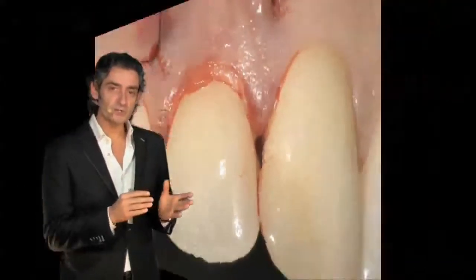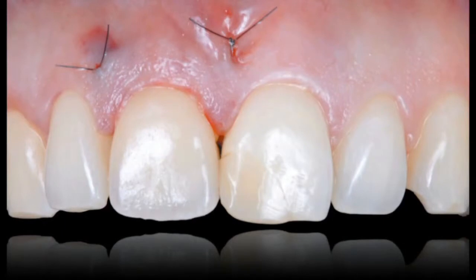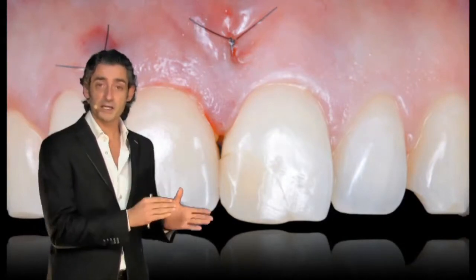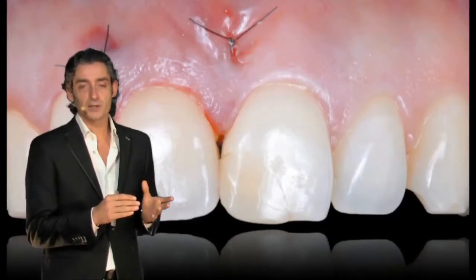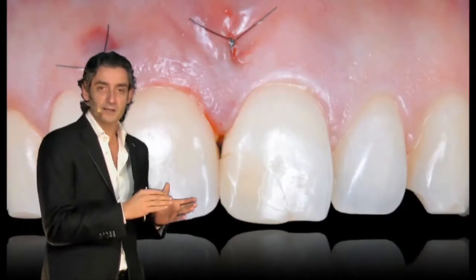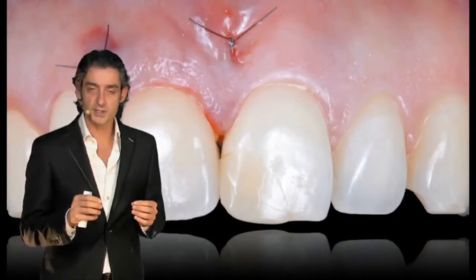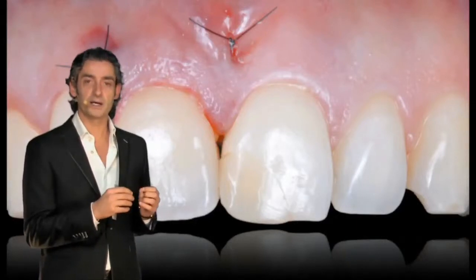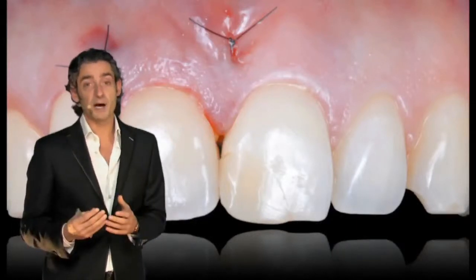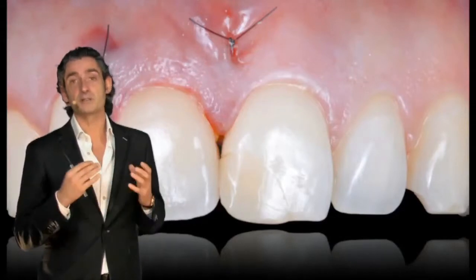About the provisional restoration, it's really important to know that if we are going to work with the final abutment at the time of the surgery, probably we can go with the cemented, because the cementation will be really around the soft tissue margin and not really deep. And if we use the temporary abutment, we normally make a screw retained restoration.